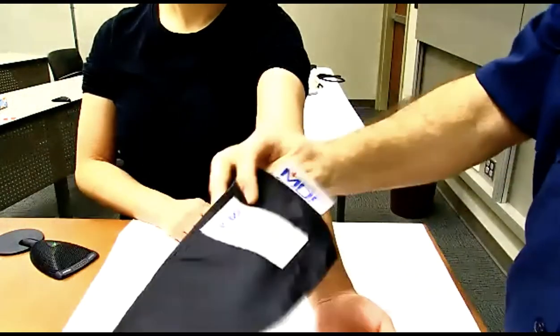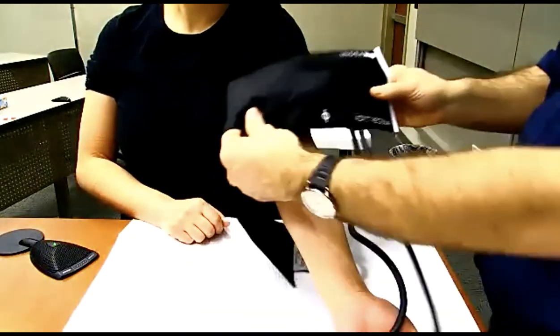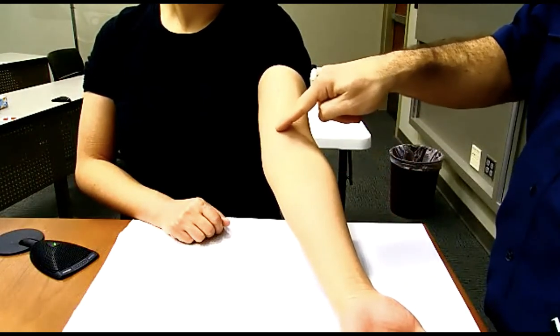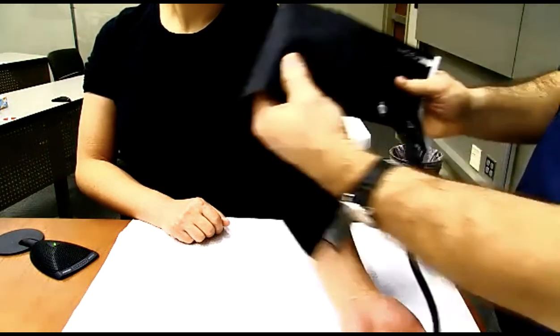Here. And open it up. And let's see, inside, outside, what am I looking for? Oh, there's the circle with the line. So what I'm going to do is remember, there's the pinky. I'm following the pinky on up, and there's the bend in the arm. So about an inch above, kind of on the pinky side, that's where I'm thinking the brachial artery is going to be. So that's what I'm going to do.